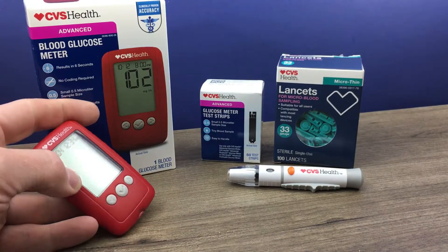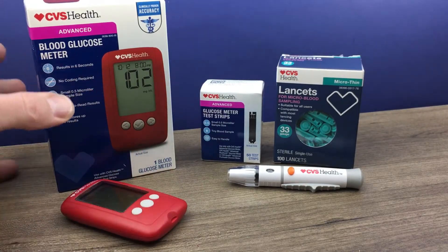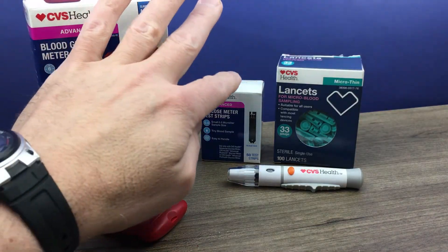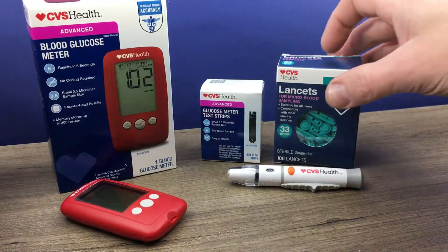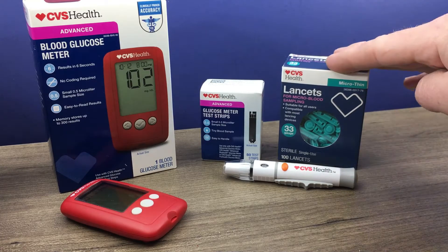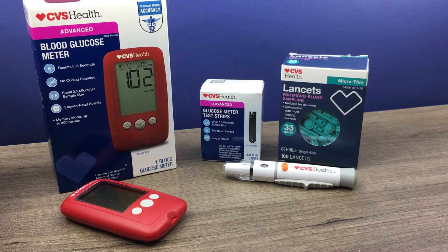Pretty simple procedure. You do need the meter, which is in this box. In addition to this, you will need blood glucose test strips. You will need lancets and a lancet device — I have our lancet device all ready to go. I do have a separate video on how to use the lancet device if you need help with that, so be sure to check that out.